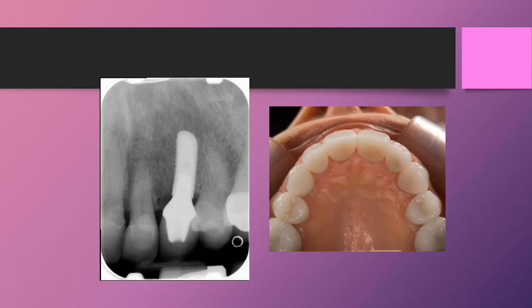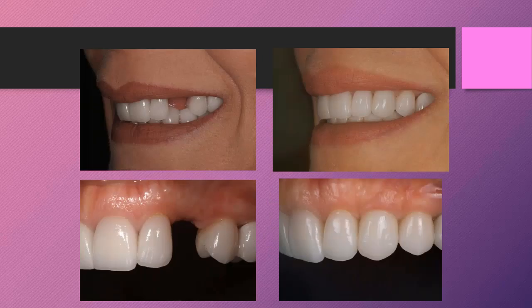The body likes it. And so they've done research on this to basically show you can put this right on top of the pulpal tissues or on gum tissues, and it doesn't cause any change in the tissues. Rather interesting. So here we can see from the side, great tissue response, heals in nicely. Tissues truly like being in this area.